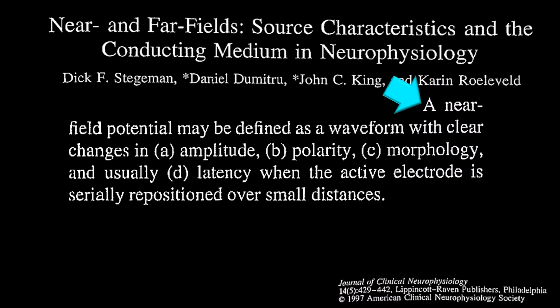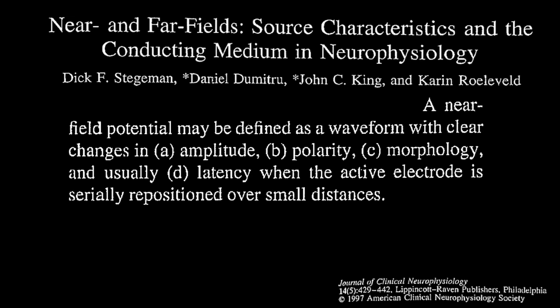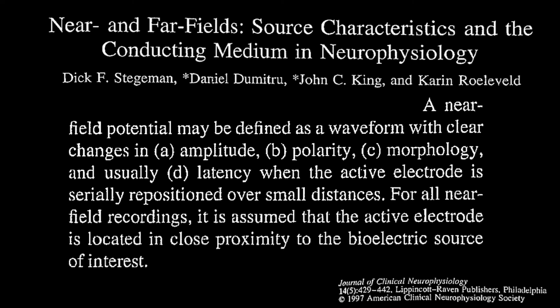It defines near field as a wave with clear changes in amplitude, polarity, morphology, and usually latency when the active electrode, that is the exploring electrode, is serially repositioned over small distances. But now comes the big kicker. For all near-field recording, it is assumed that the active or exploring electrode is located in close proximity to the bioelectrical source of interest.